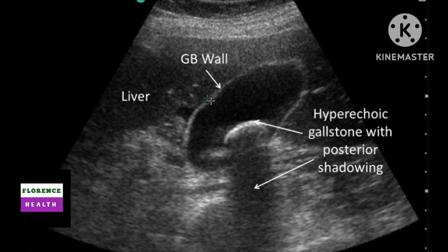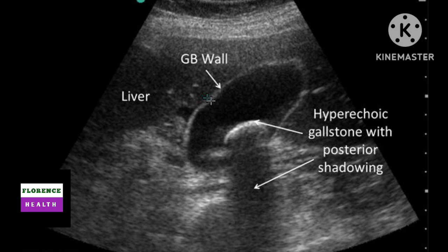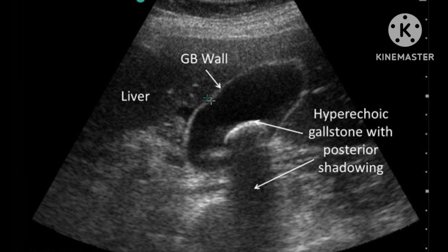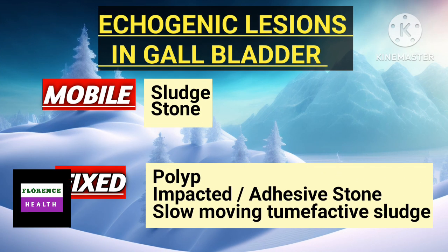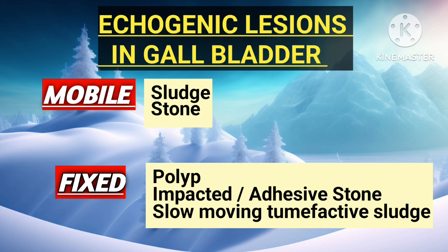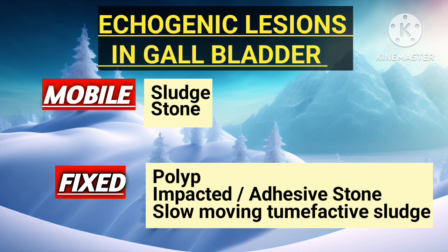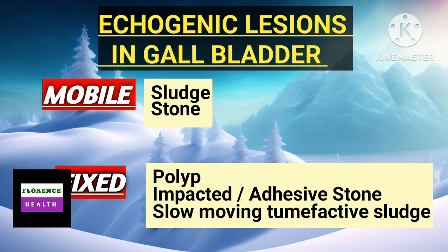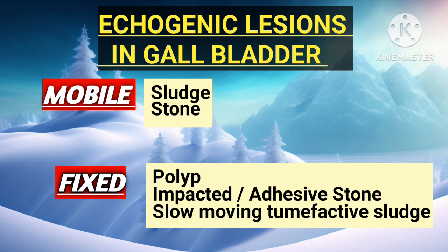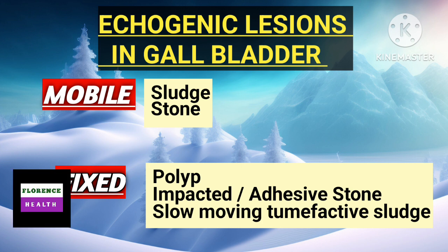This image shows an echogenic structure inside the gallbladder having posterior acoustic shadow. Now, some echogenic lesions inside the gallbladder are mobile, and some are fixed or immobile. Mobile echogenic lesions include sludge and stone. Immobile or fixed echogenic lesions include polyp, impacted or adhesive stone, and slow-moving tumefactive sludge.